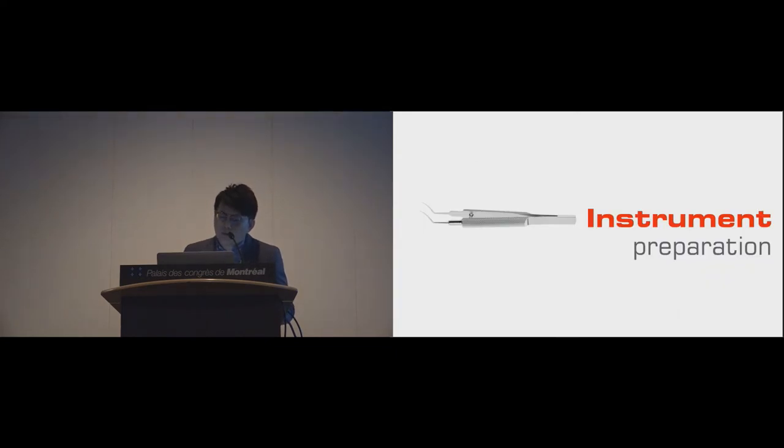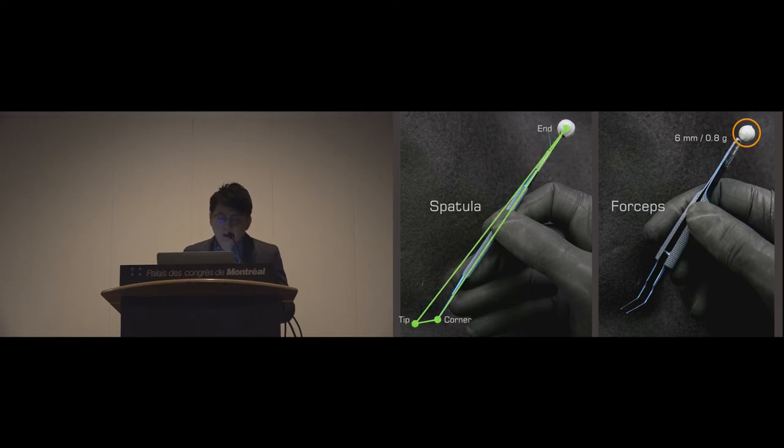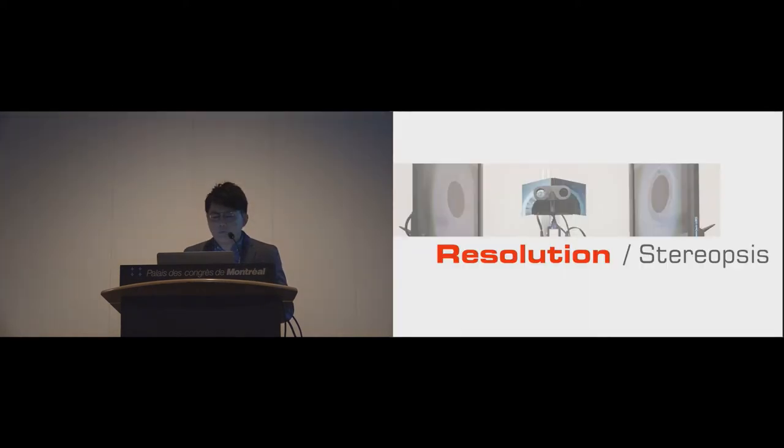We only need two simple steps to prepare the instrument. First, we have to attach one reflective marker to the distal ends of the instrument. Users' performance won't be affected by this marker because of its tiny size and light weight. The next step is to measure the distance between three landmarks of the instrument.